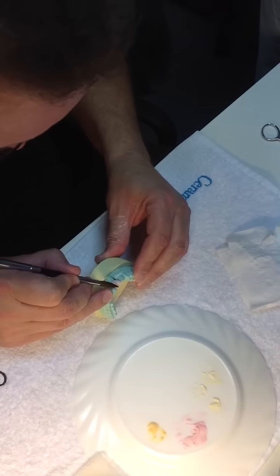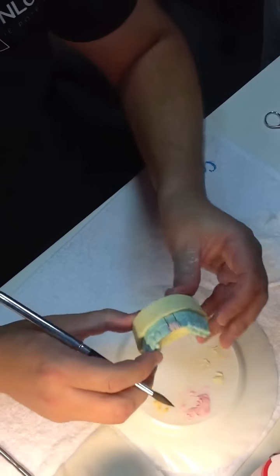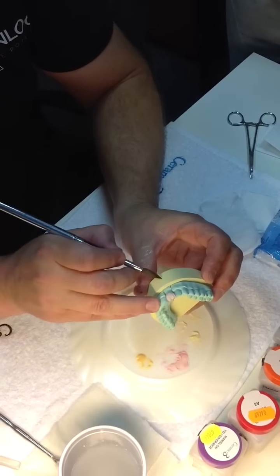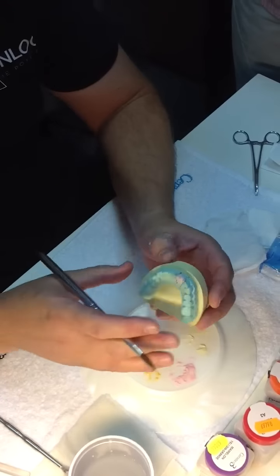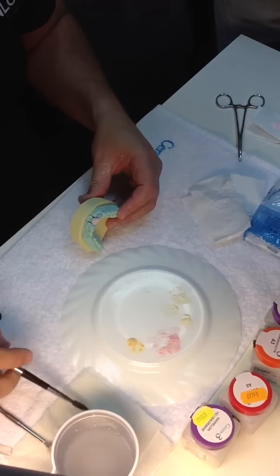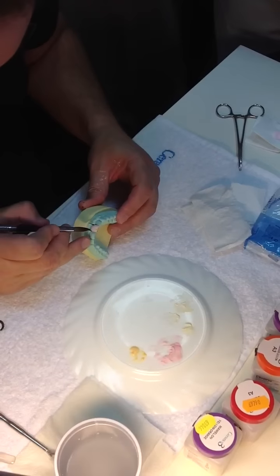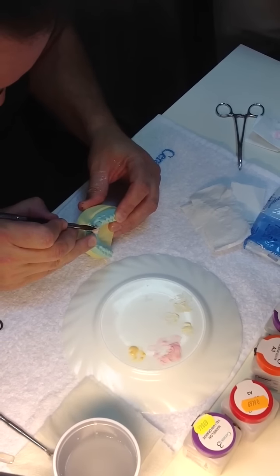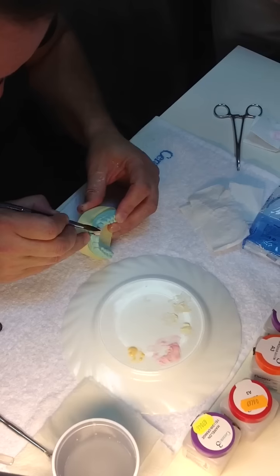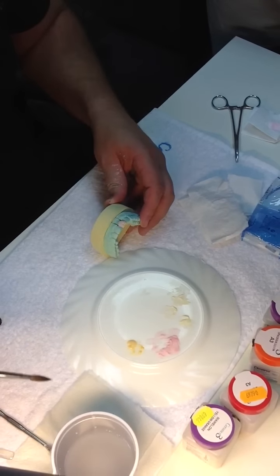Just placing it on the mamelon ridge. Place a small drop on the mamelon ridge and then blend it down so we get a nice blend, just running through. And the same on the distal.